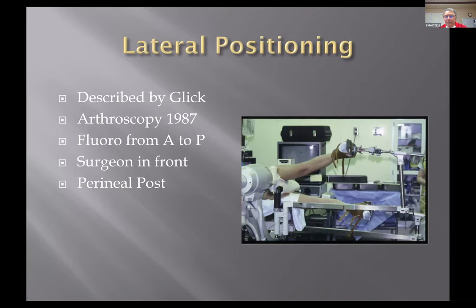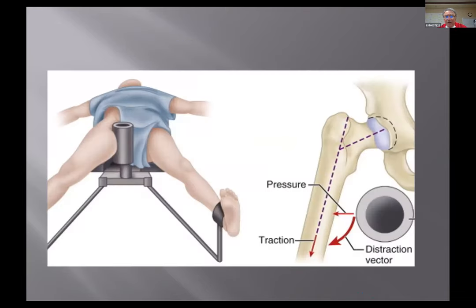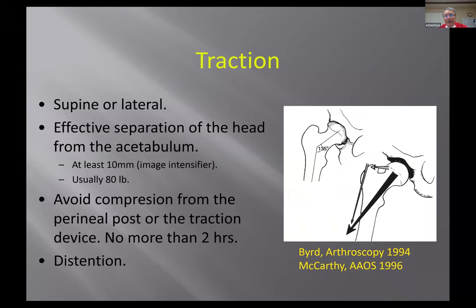There are a few people that do lateral arthroscopy. I just show this picture to show you a lateral setup, but the majority of us do a supine, and you can see where the pressure is. The pressure's on the upper lateral thigh, the upper medial thigh to get lateral displacement, not against the ischium. We're not trying to push against the labia or the scrotum. I call it a Michael Jackson sign. If I get a glove between the post and the groin, I tell them that I'm not going to smash their, you know, what's when I'm doing the case, and then I'm not going to get a pudendal nerve problem or a purple scrotum.